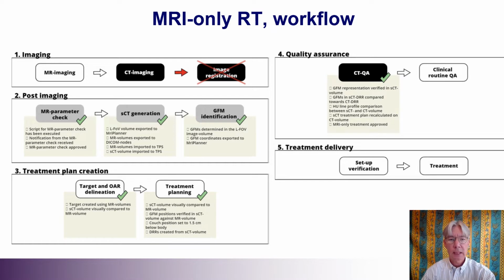I will use this outline throughout the presentation. It was originally made by my former PhD student Emilia Persson for presenting her thesis. So it divides the workflow into certain steps and addresses different tasks that need to be carried out when you go from a combined to an MR-only radiotherapy workflow. And I will go through these steps one by one.